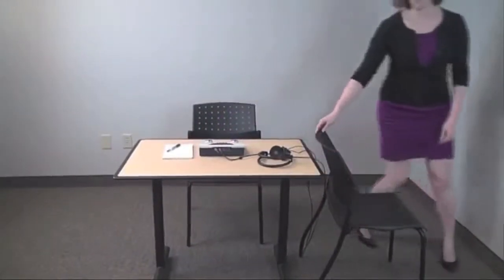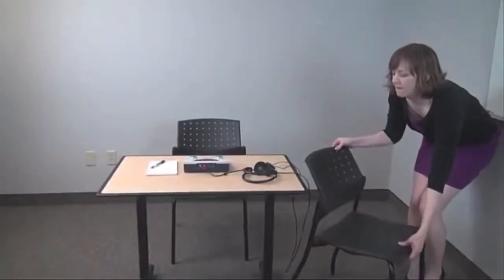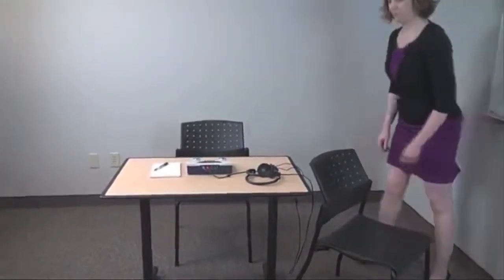Have the child face away from the tester and orient them at about a 45-degree angle. This way, the tester can still keep an eye on the child, but the child should not be able to see the tester adjusting the audiometer.